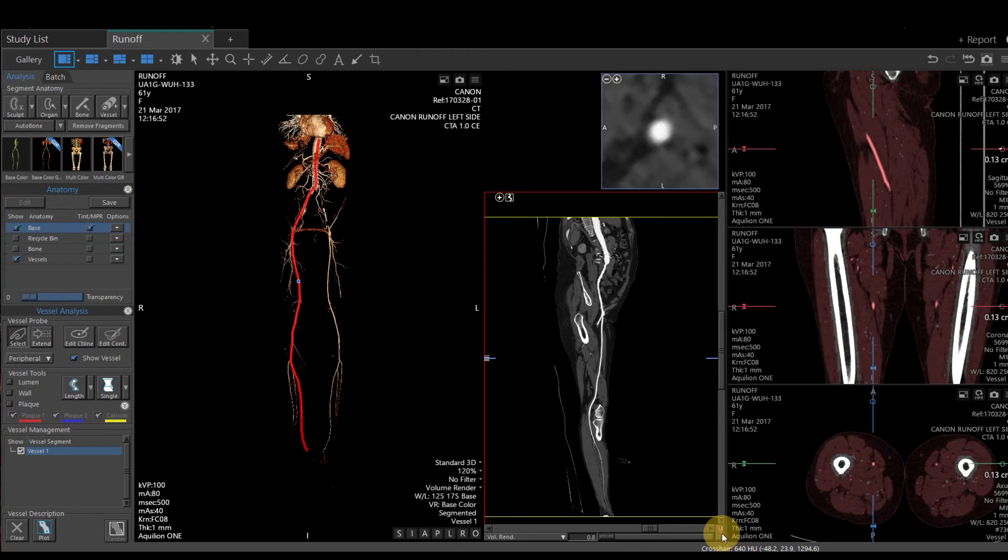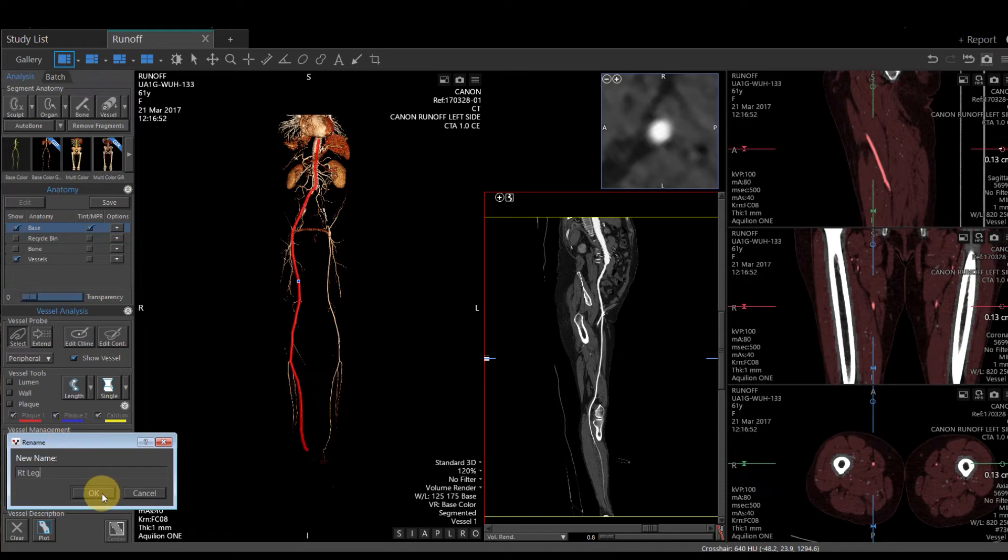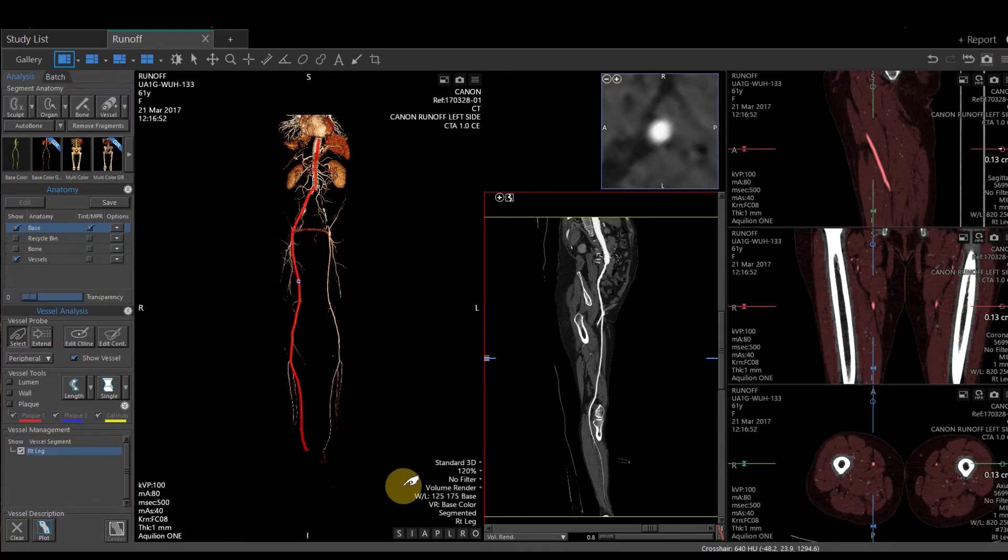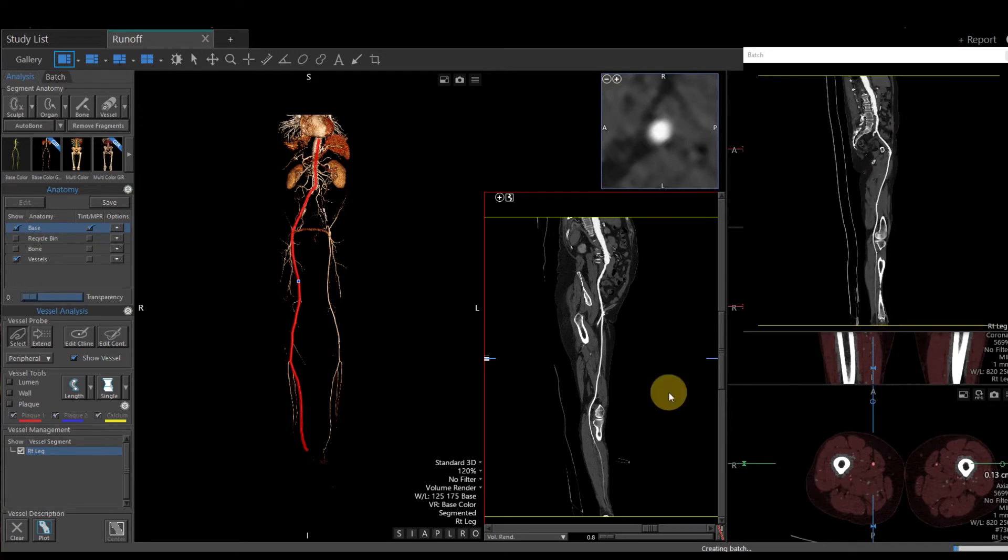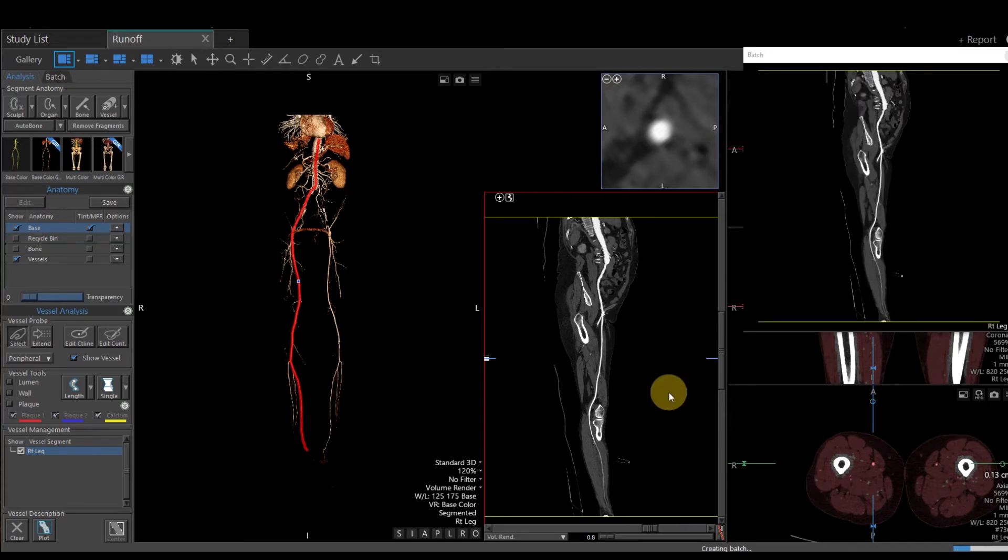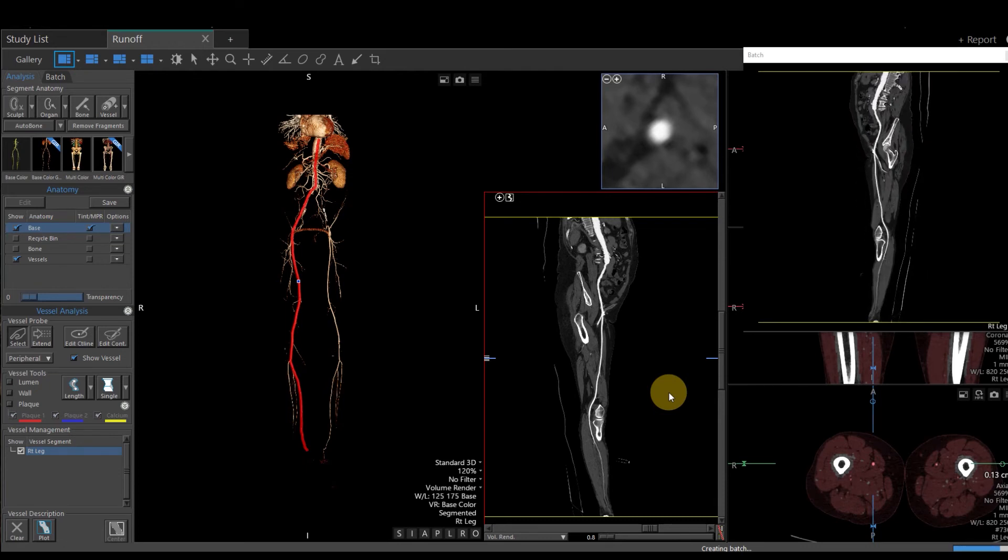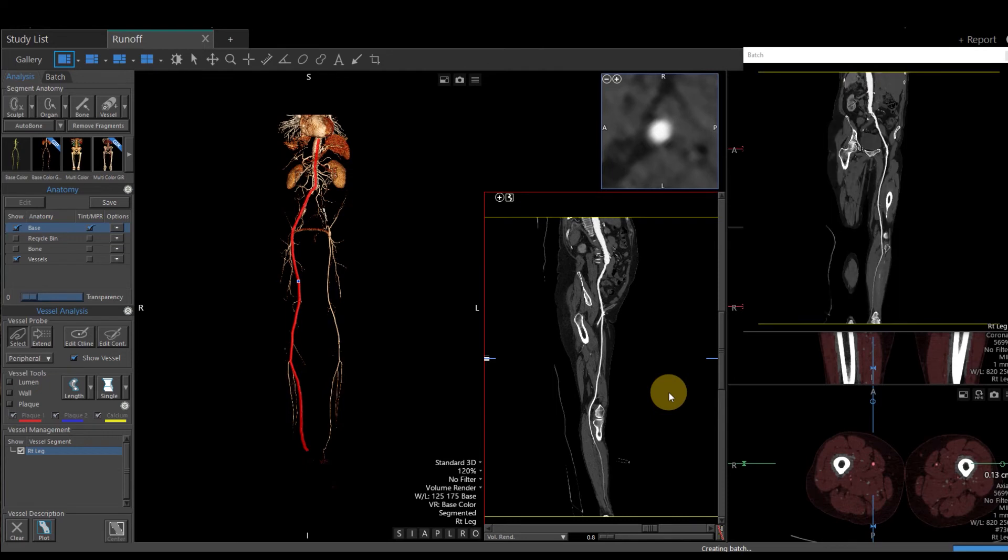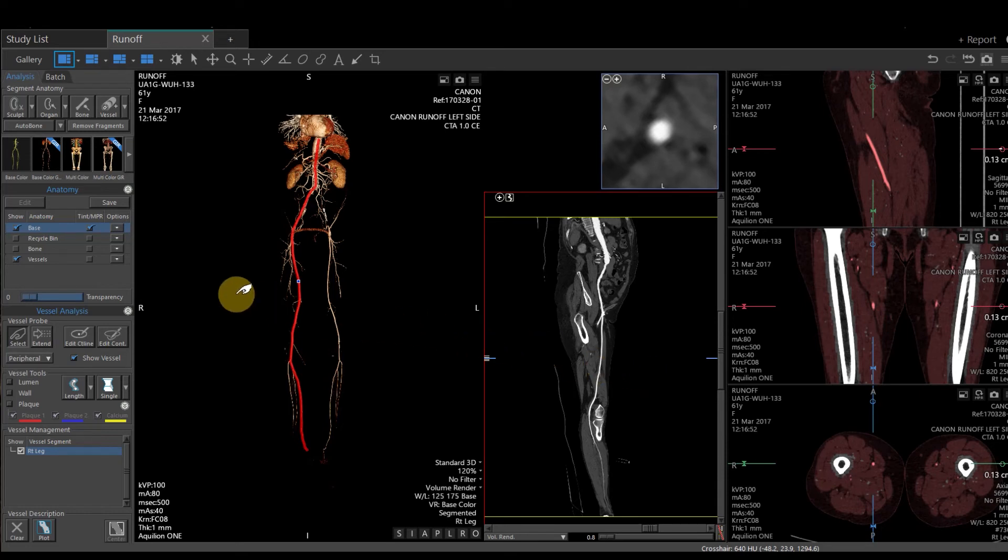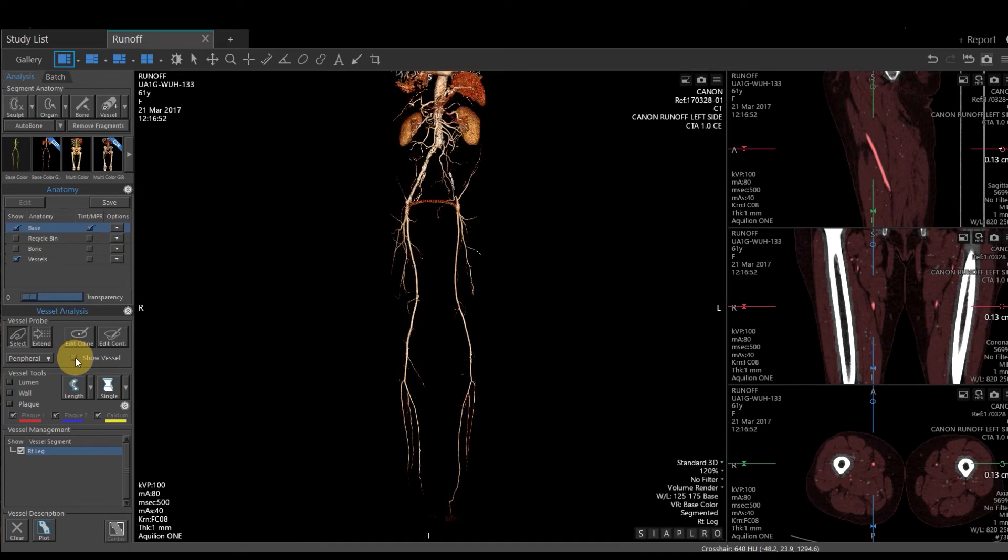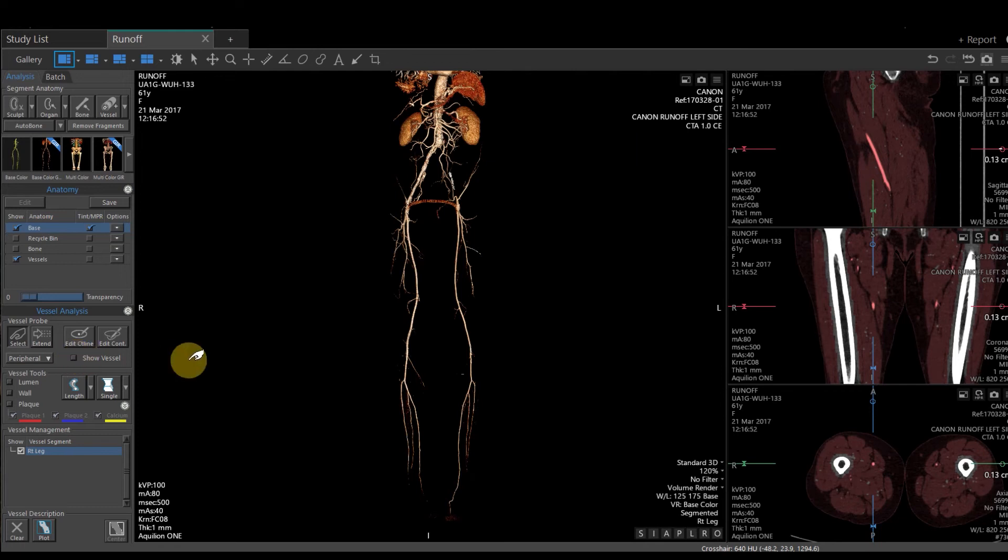One option that you have under the single vessel view is I can rename my vessel. So let's just say I'm going to name that Right Leg. I'm going to hit OK. You have the option of right clicking in the curved planar viewport, and you can create a batch rotation. That's going to rotate around that vessel 360 degrees. That will save that to the study list. To toggle off the curved planar reformat, on the left-hand side of the screen, you have a button that says Show Vessel. By unchecking that, you can turn off Show Vessel. Checking it back on will bring back your curved planar reformat.